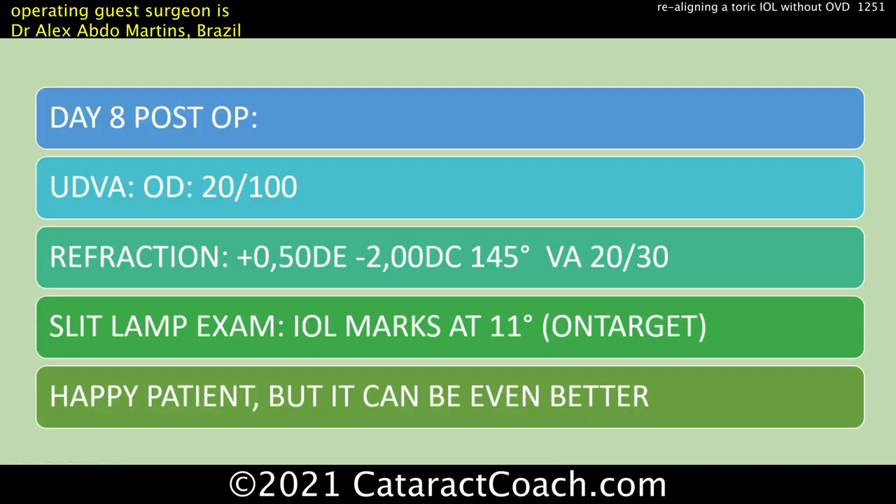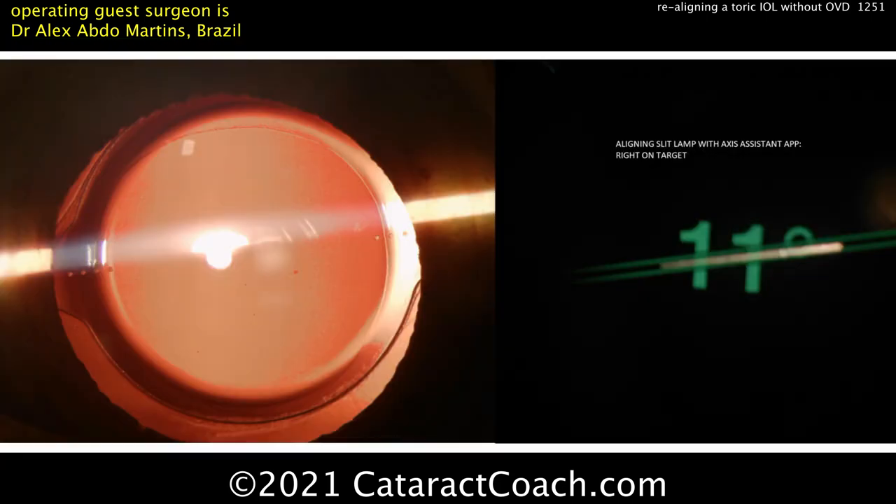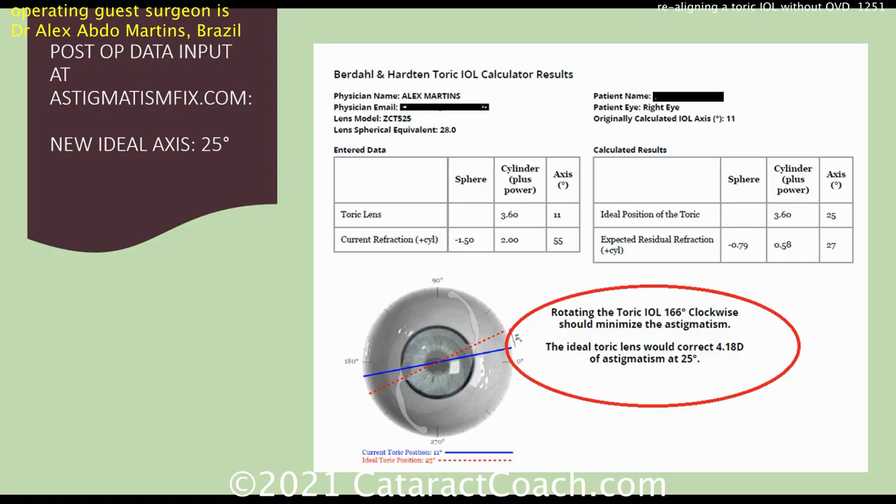Day eight post-op: 20/100 vision. Look at the refraction — plus a half, minus two at 145. But the lens looks like it's really on target. Patient is pretty happy as is. You can see it's measuring exactly at 11 degrees — the lens is at the intended axis, literally right on target. But can it be better?